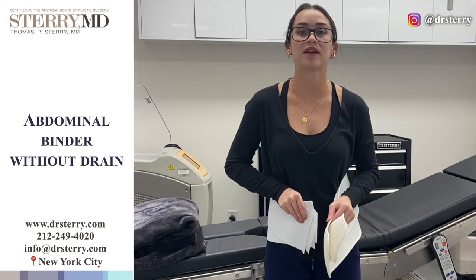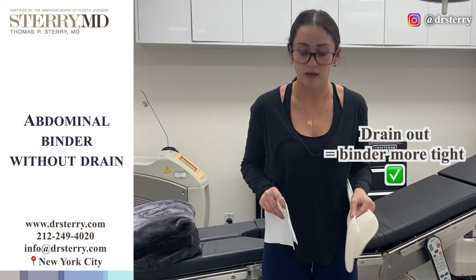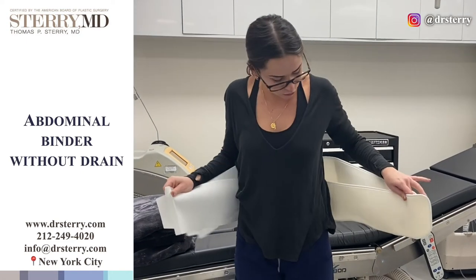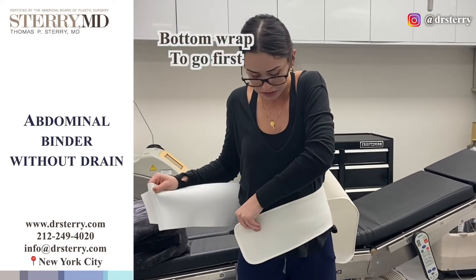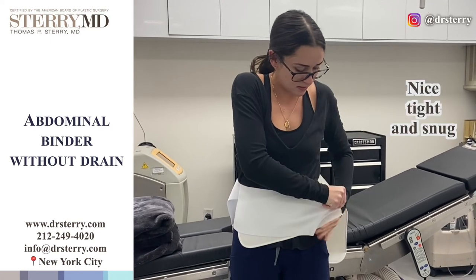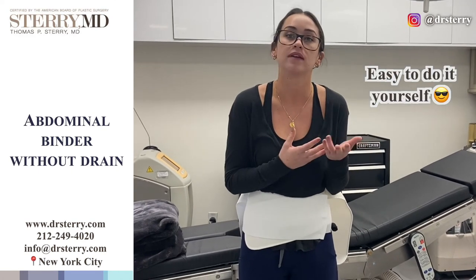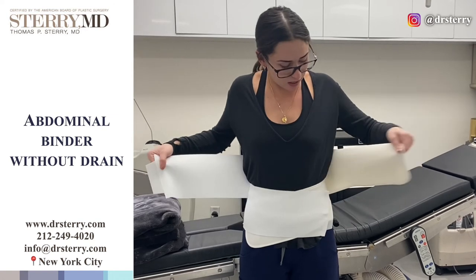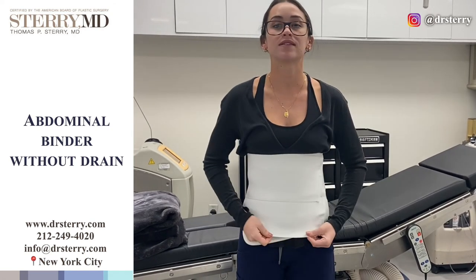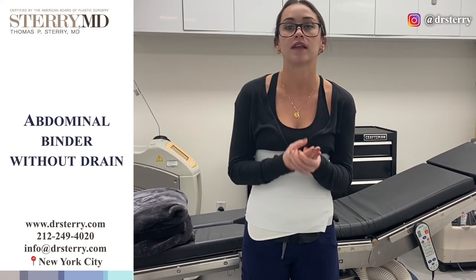Once your drain is out, that is when we ask you to wear this binder a little bit more tight, to ensure that no fluid collection occurs and it'll also help you with your swelling. Ensuring that the arch is at the top of your bum, you want to wrap the bottom piece first, covering the incision. You can pull it tighter this time and then pull that bottom piece over, ensuring that it's nice and tight and that you are snug in there. It's also easier if you have a caretaker or a companion help you with this. Then with the top, pull over and bring this over more tight. This way you're nicely compressed and snug in the garment, and this will help with swelling to ensure that no fluid collection occurs and that swelling is manageable.